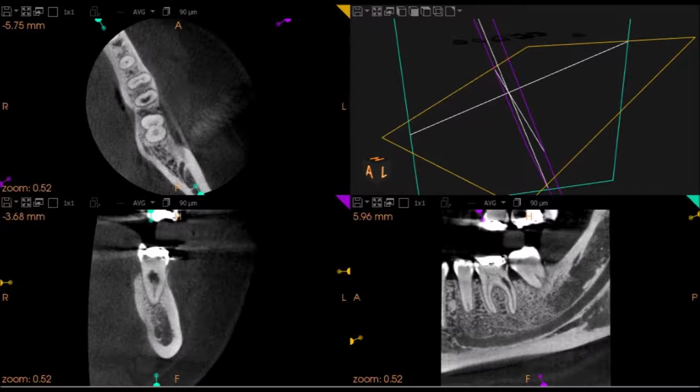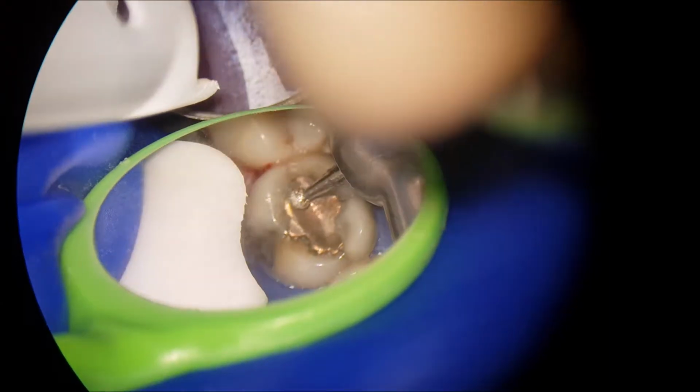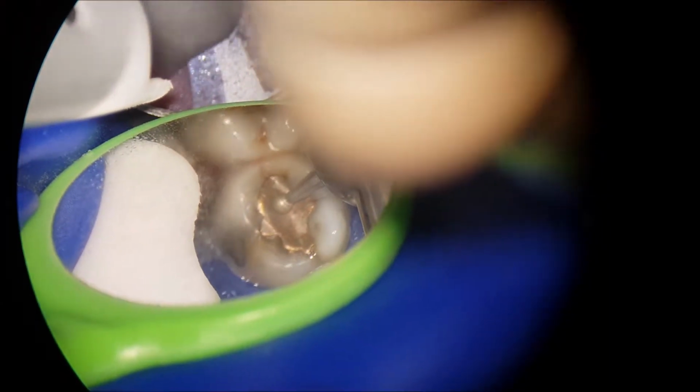Left-hand top and bottom images shows the lesion, the resorptive lesion. No perforation, mercifully, but it also shows on the axial view top left where there's a dent in the buccal cortical plate, very likely caused by a traumatic extraction of the 3/7, and then the 3/8 was simply left to drift forward into position. I postulate that the extraction may have triggered the internal resorption, but it's just a theory.